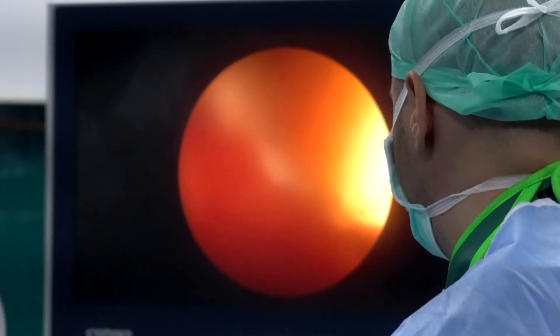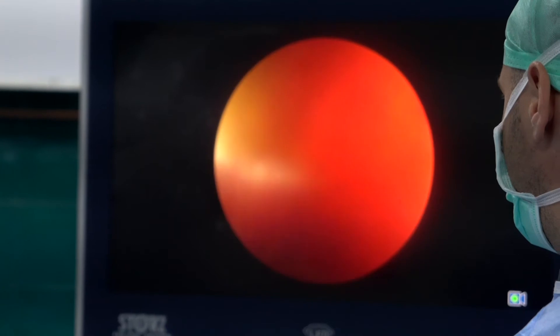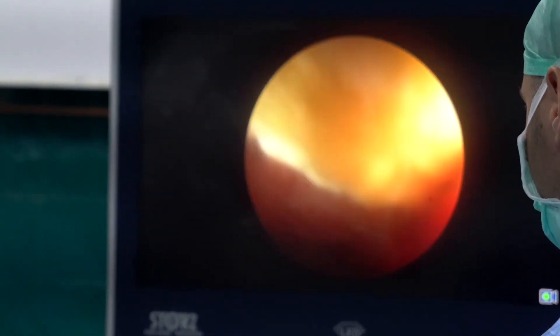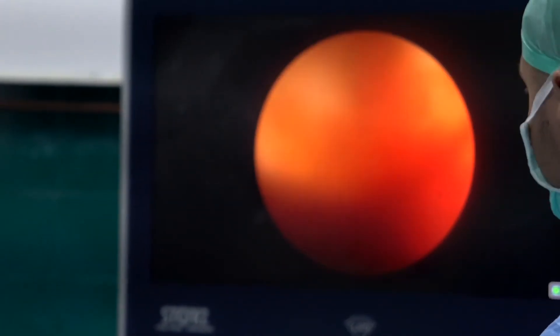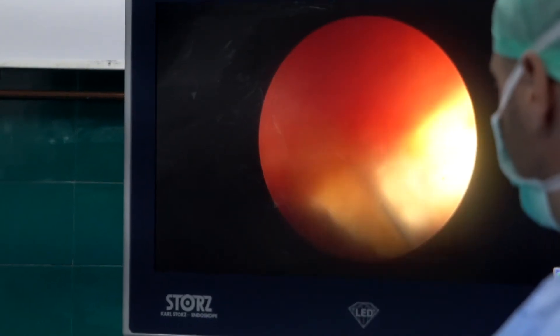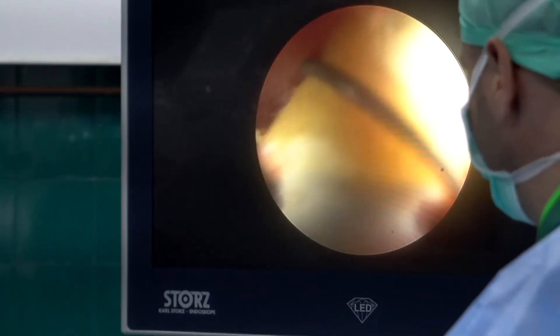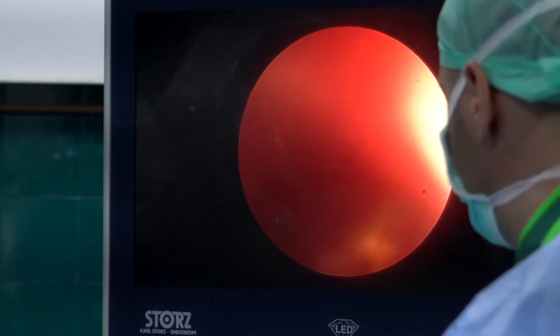With the same device we also have ballistic lithotripsy available as well. It has different sizes of probes — we are now using a 2mm probe to fragment the stone with ballistic energy. With ballistic lithotripsy we have to extract the fragments separately, whereas with ultrasonic processing you can have continuous fragmentation and aspiration.